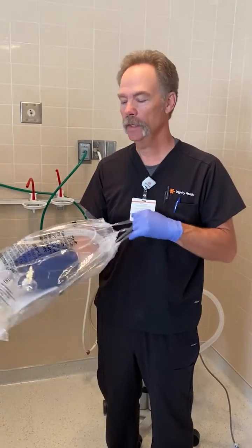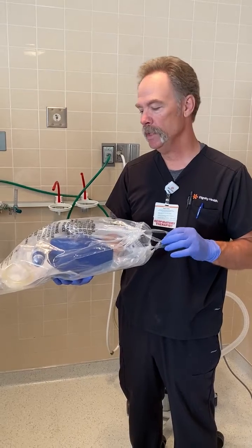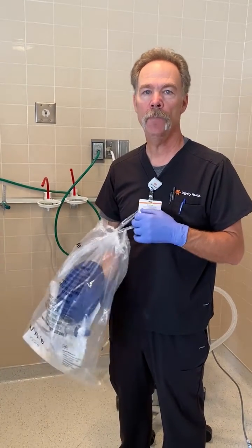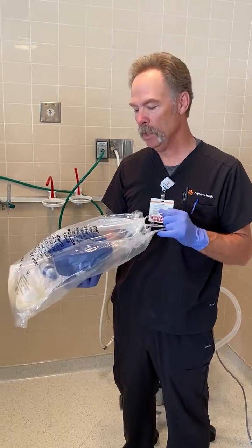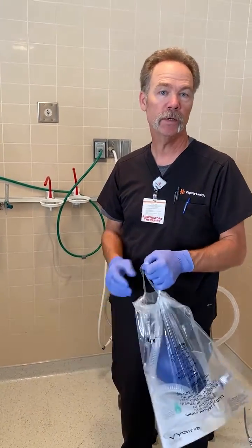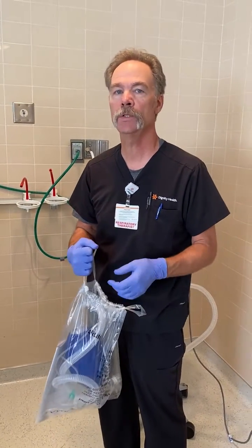Hi, my name is Frank. I'm your guest respiratory therapist today, and I'm going to show you how to use a manual resuscitator, AMBU, or a bag mask unit — whatever you want to call it — on your suspected COVID patients or your COVID-positive patients that you'll need to do some respiratory support for.